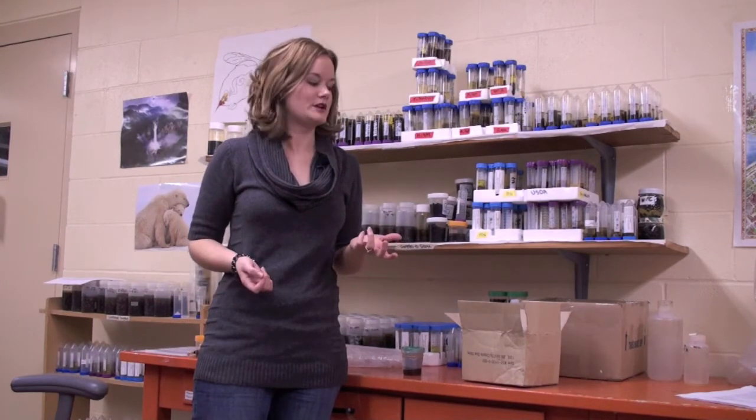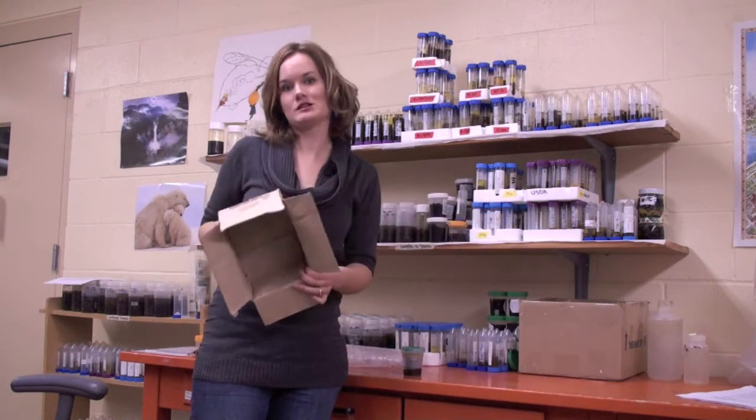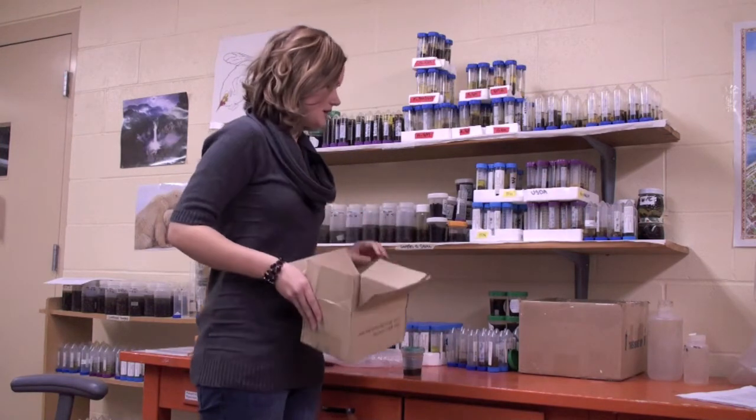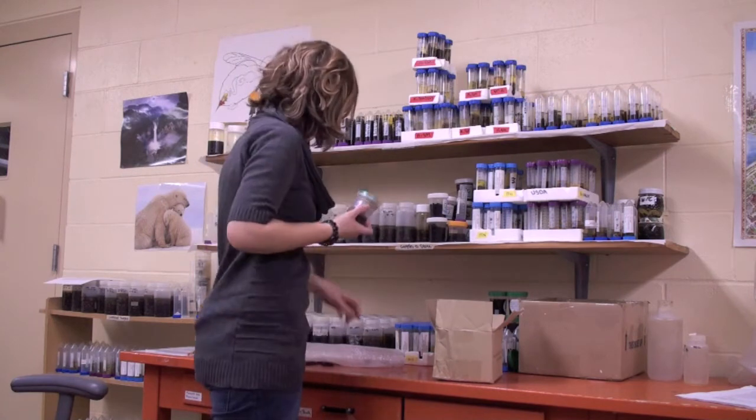Okay, so we went over the registration form and what to put the sample in and how to pack it. But now I'm going to show you what I need you to send it in. So you can send it in a padded envelope if it's one sample, 1 or 2 samples. Otherwise, use a box. So this little box is a good example. And then here we have your sample reinforced with wax paper.